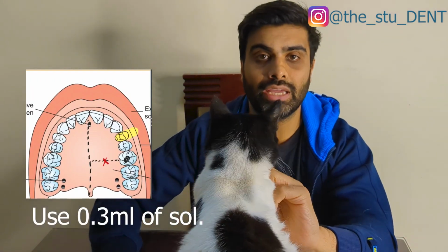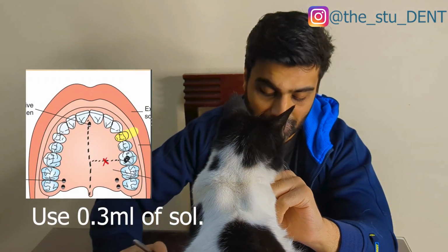So go ahead and inject that very, very slowly. And there's one key thing that I missed out, my apologies for that. The palate is a structure within the mouth that has a very small amount of tissue between itself and the surrounding oral cavity. That thin layer of palatal skin is essentially the only thing between the oral cavity and the hard palate bone itself. So once we start injecting this region, it can be very, very painful.